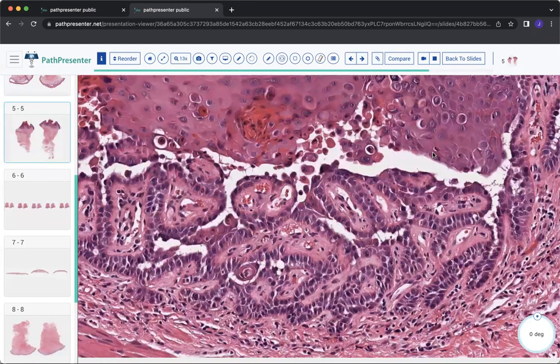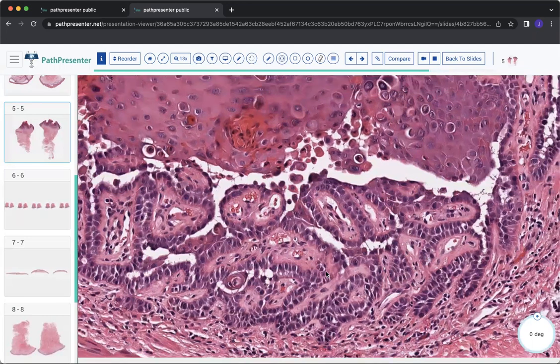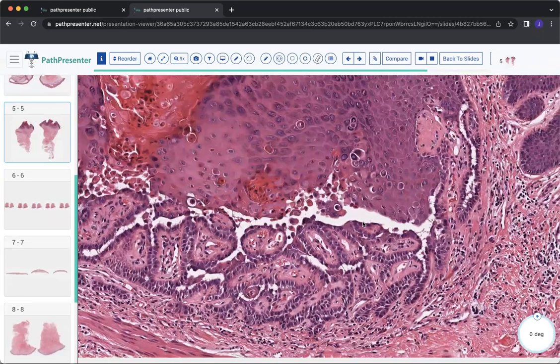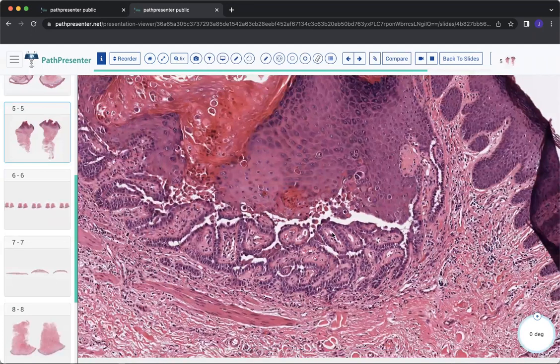So if you see small papules with acantholytic dyskeratosis, or even just a bunch of acantholysis without dyskeratosis, it still could all be in line with a Grover's, but the size of each individual area that's involved is not very large. And clinically, it's just not as striking as Darier's or as Hailey-Hailey.